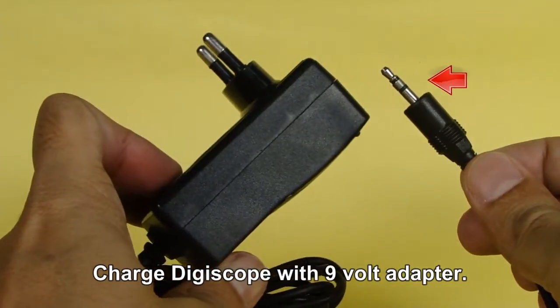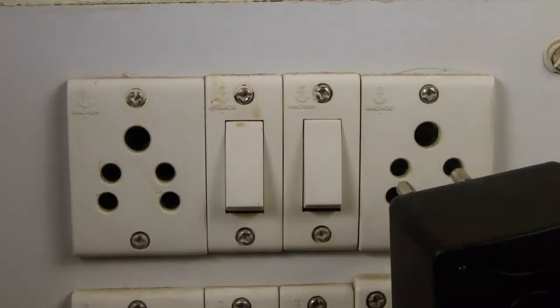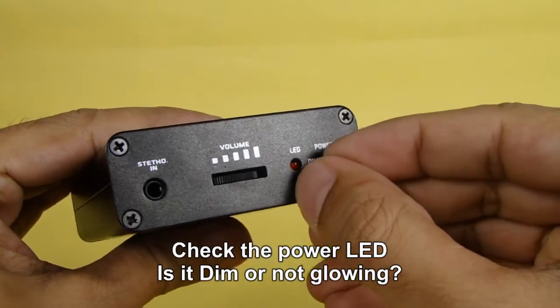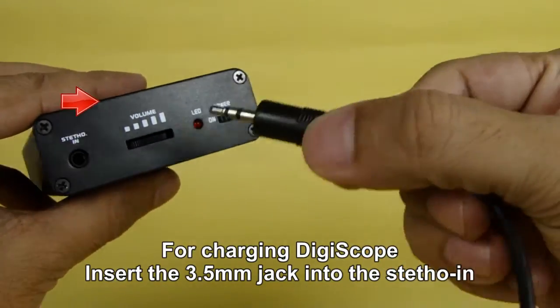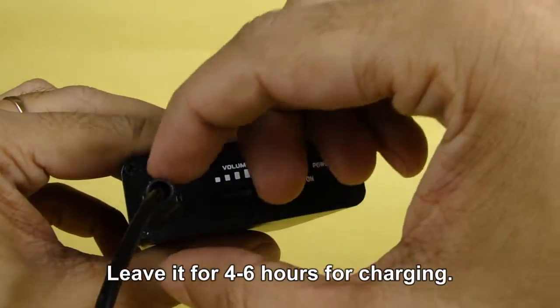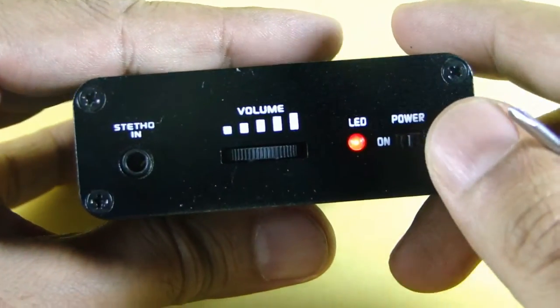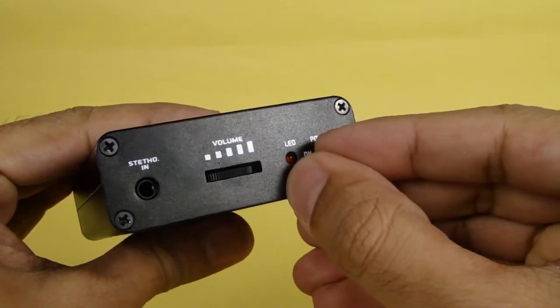For charging the digiscope unit, use the 9 volt adapter. Plug it in. Check if the red light is dim or not glowing. Insert the jack into the stetho-in port on the front panel and check if the red light is lighting up. Leave it for 4 to 6 hours for charging. After the unit is fully charged, the red light will glow up. If not, charge it for some more time.